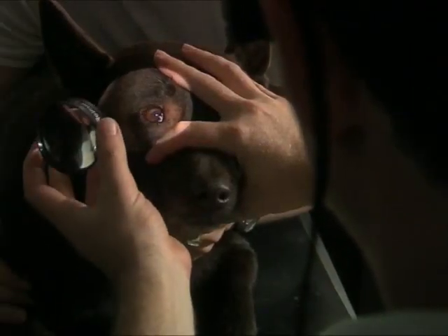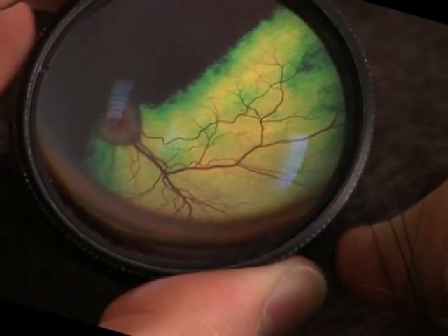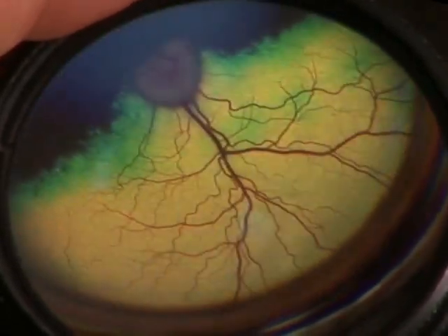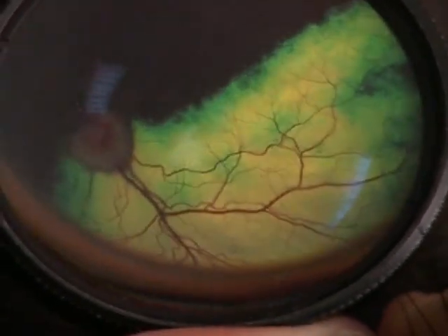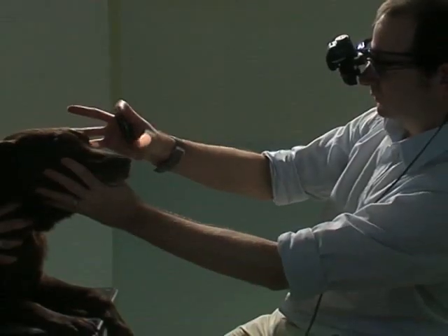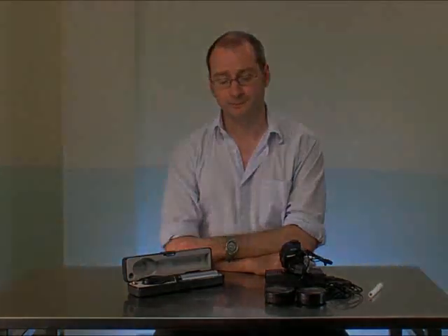The main advantage of the indirect ophthalmoscope is that you get a much larger field of view, so you can see more of the fundus area in one viewing than is possible with the direct ophthalmoscope. One disadvantage of using the lens is that it inverts the image both upside down and back to front, and orientation can therefore be a little bit more complex. But once you get used to it, it is very handy to get an overall view of where lesions may be located and how significant they may be, because you'll determine how much of the fundus is involved.